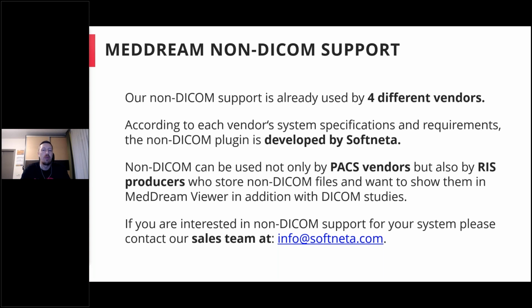So if you also are a PACS vendor or RIS producer and you would like to show non-DICOM files in addition to the DICOM files, it is possible to have such functionality. You can always contact our sales team, discuss your needs, discuss the workflow, and it can be achieved.